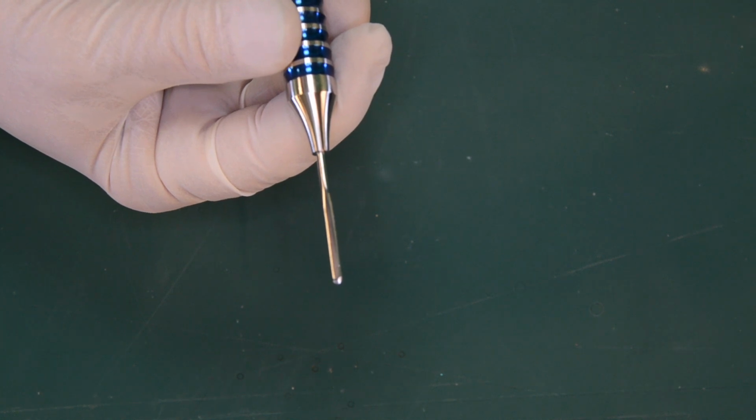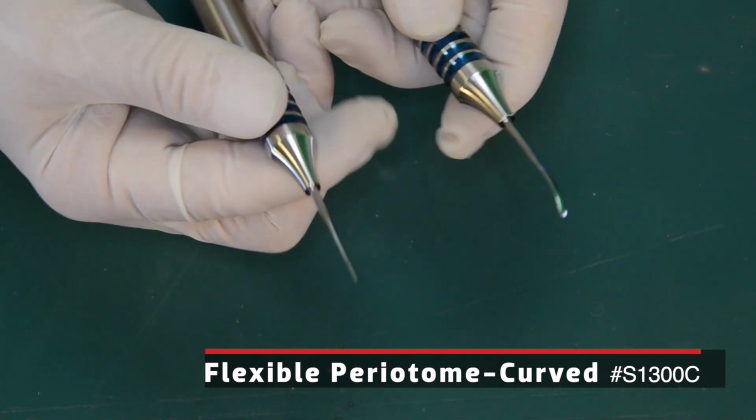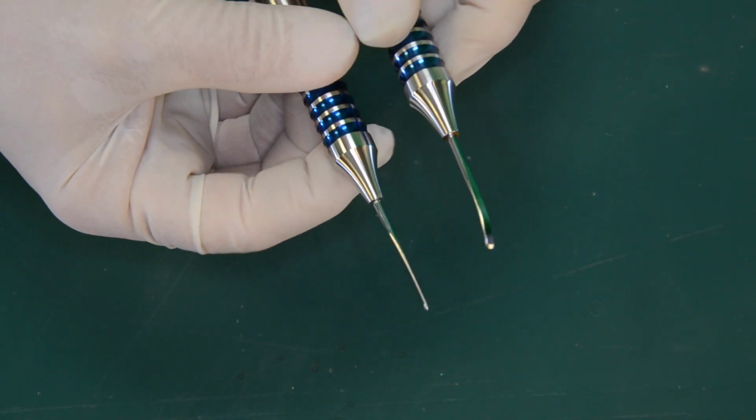Again, we have a straight version and a curved version. You can see how these tips are flexible so they can track up the ligament, but that means these are not elevators and you don't twist these instruments. If you do twist these instruments, they will fracture.